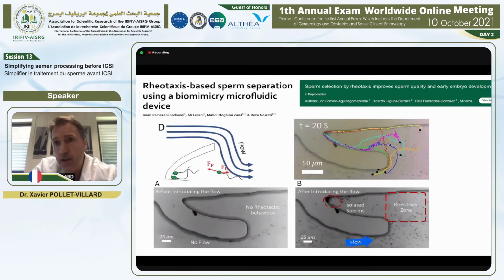What I wanted to present to you is this new study about a rheotaxis-based sperm separation, which uses a biomimicry microfluidic device. It's a really new study. It's been published, I think, one month ago. And this is very interesting. This is a microfluidic device, so there is an active flow, okay?